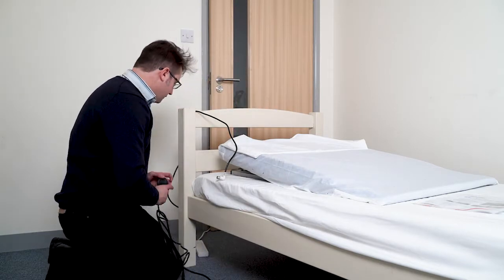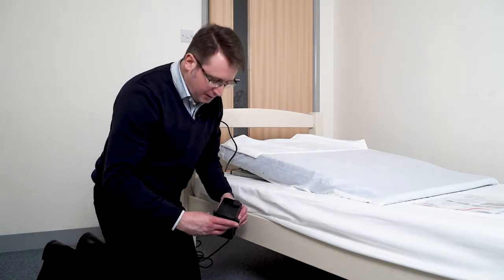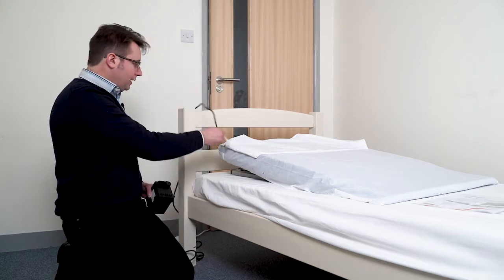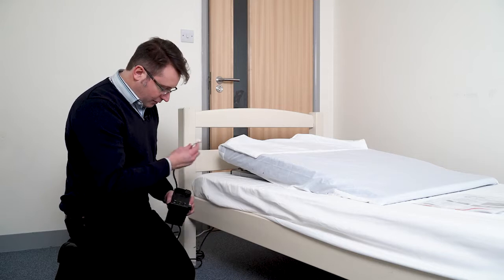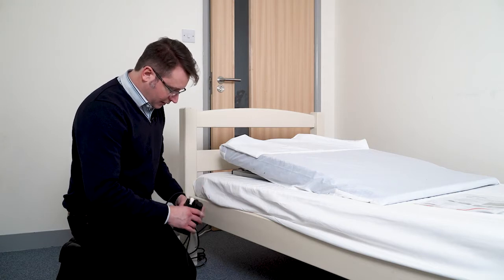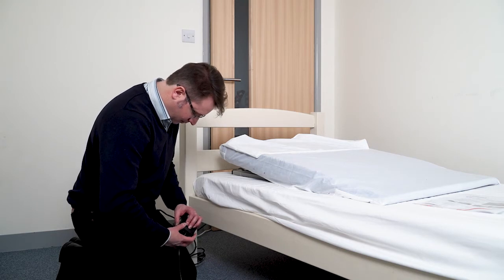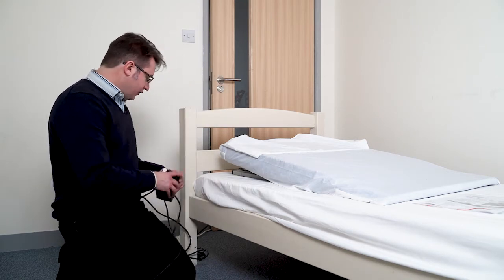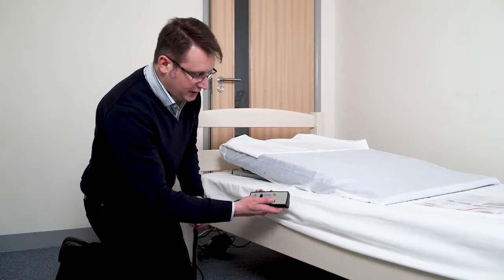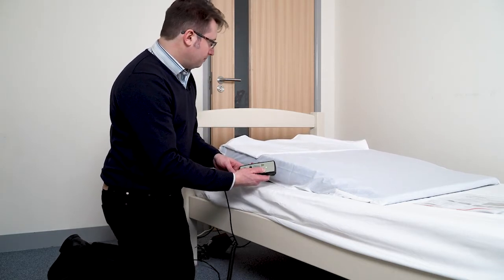So if I plug this one in to the power socket that I have behind me, there's a cable strain release strap on the transformer which I'm going to remove. And then the PillowLifter simply has a cable with a white plug on it, which is going to plug into the left socket, and the hand control is going to go into the middle socket. And then I'll replace the strain relief strap. You can tuck the transformer out of the way so that it doesn't present a trip hazard or anything else. And quite simply, if I just demonstrate, if I unlock the hand control, and then it will elevate and it will go back down again.